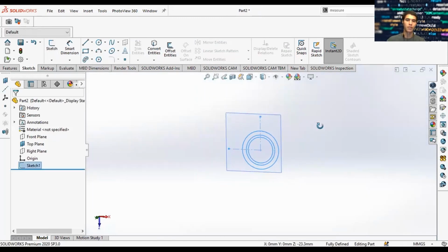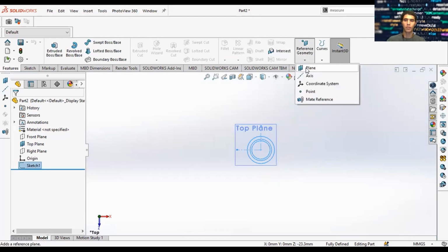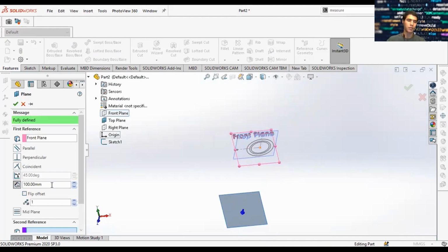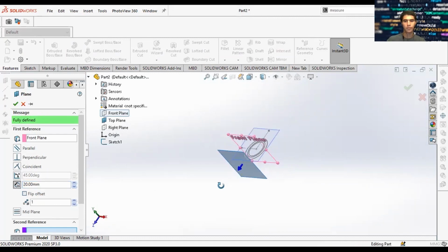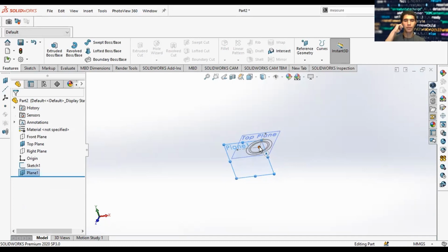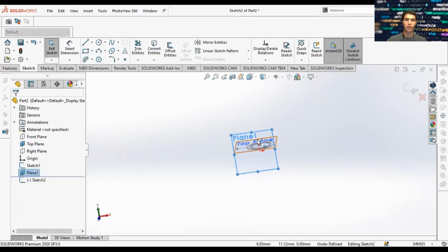So we have our top plane, and now we're going to draw a new geometry. So we're going to go ahead and draw a new plane. Let's make the front plane our reference. So now we have a new plane called plane 1, and it's an offset from one of our main planes, the front plane. So I'm going to sketch on this front plane offset.